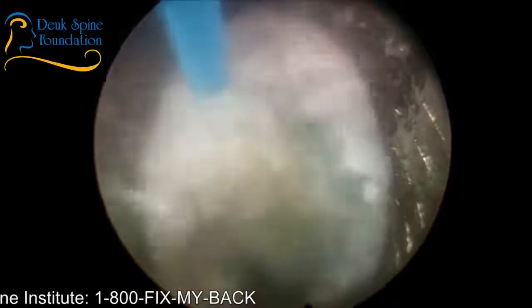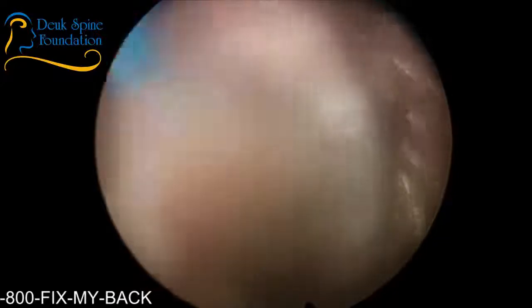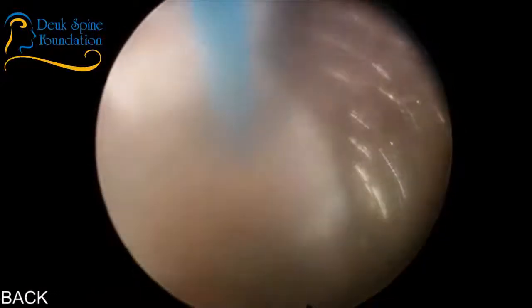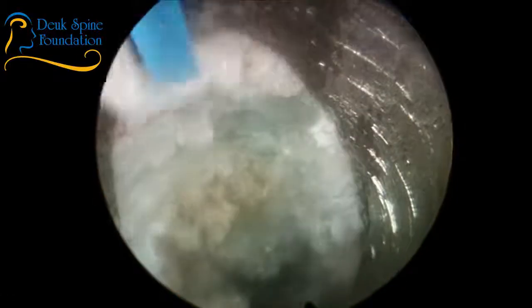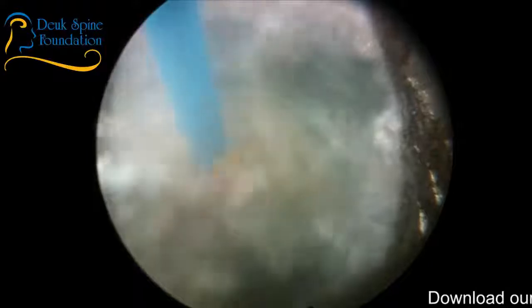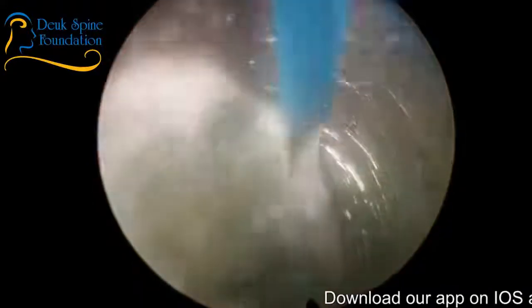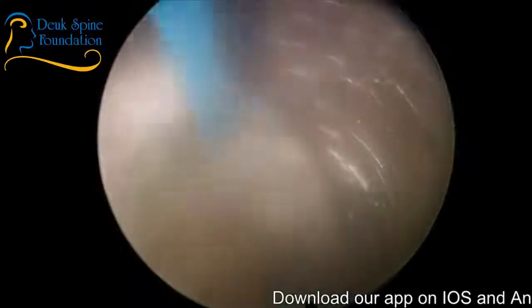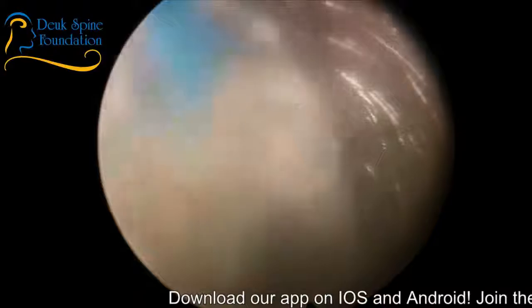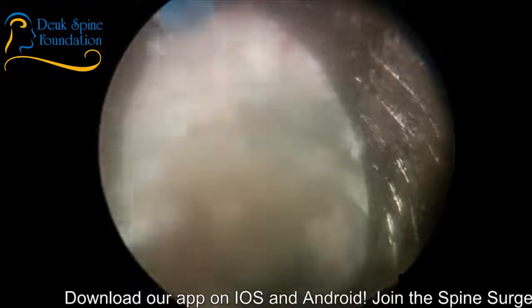All right. I apologize for the poor visibility, folks. That's just a little bit of bleeding. Very minimal amount. As a matter of fact, it would be akin to you clipping your nail with a nail clipper and having a small amount of blood on the end of your finger. It's just that we're using a magnified view to see it all. That's why you're seeing it the way it is.